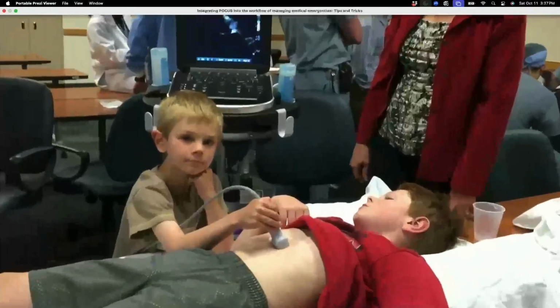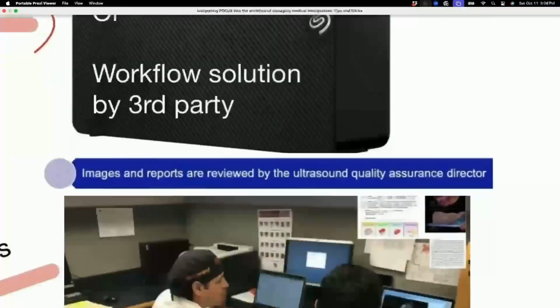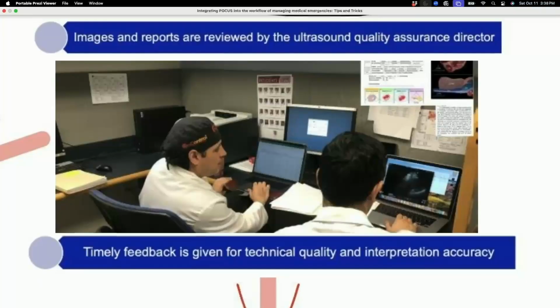I think we're going out of time, but I just want to share with you that to really progress and avoid issues with point-of-care ultrasound training, you always need to save the images. That's why in our institution, we don't interpret any live images. All images have to be saved and then looked at after. We review the images, and the ones that meet criteria for indication, we send to PACS.